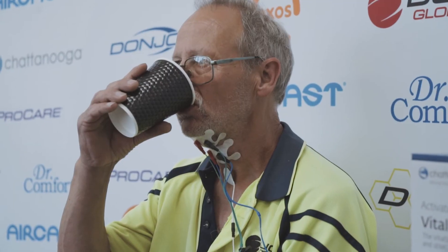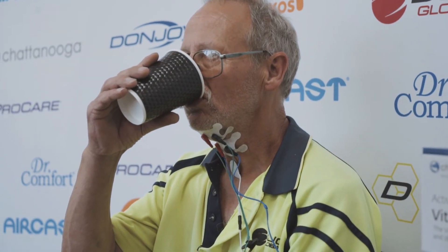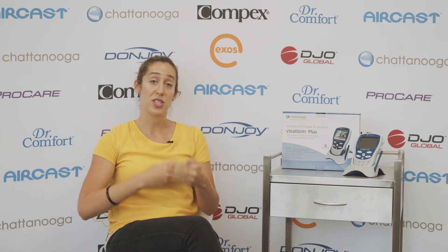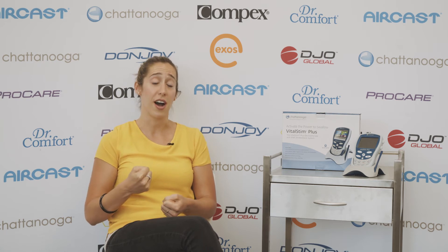Every time those muscles contract — if you think of it like the gym, going for a walk versus going on a treadmill or lifting weights — the muscles need to be moving. And as they're moving, the electrical stimulation makes them contract a million times harder and makes the muscles work a lot harder, so they get stronger and more coordinated.